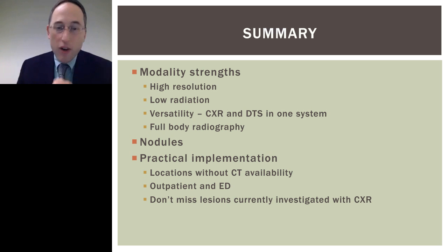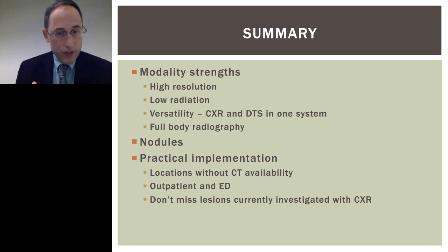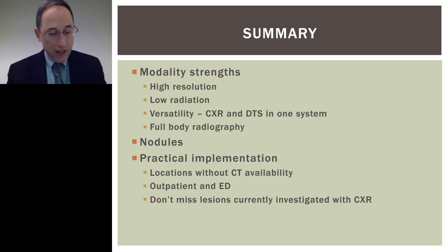So I think there are modality strengths, and one of them is high resolution, absolutely. The fact that the radiation is only about double what it is in chest X-ray, the fact that you can have tomosynthesis in sites that are designed to have a chest X-ray, whereas you wouldn't be able to put something like a CT scanner there.